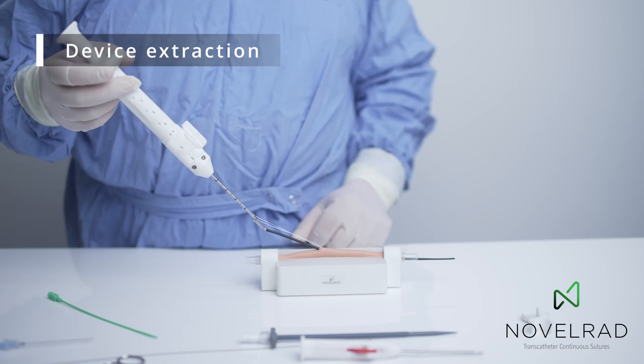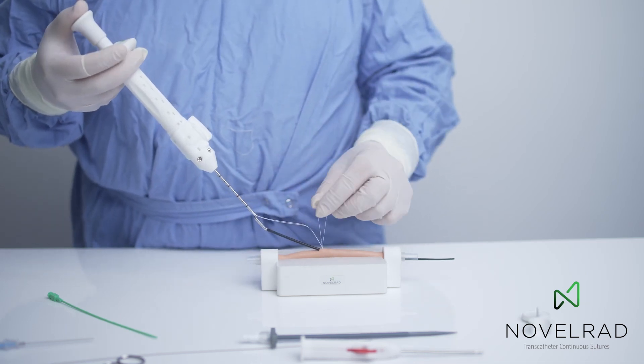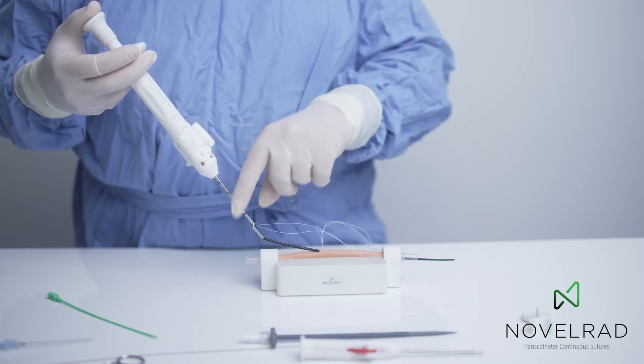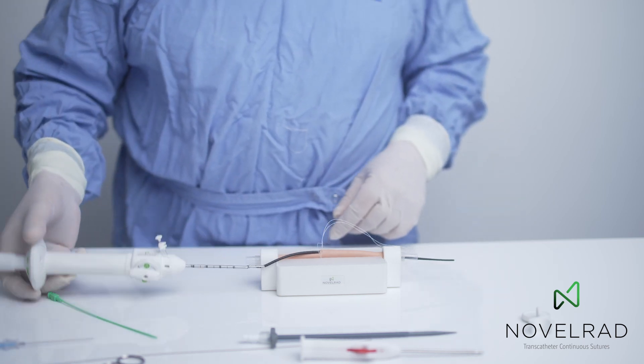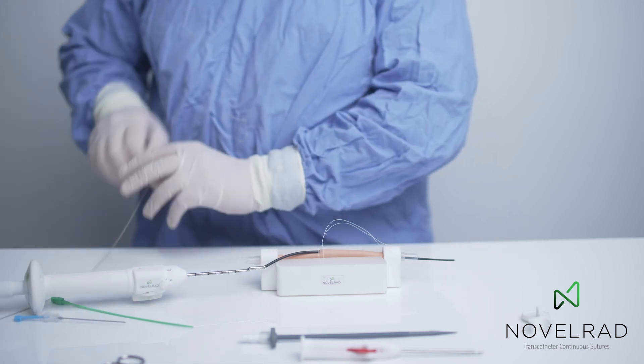You can see the sutures. Now the micro needle is released, and the suture ends are released and pulled out, placed on either side of the vessel for knotting after the procedure. To maintain position, we replace the guide wire.